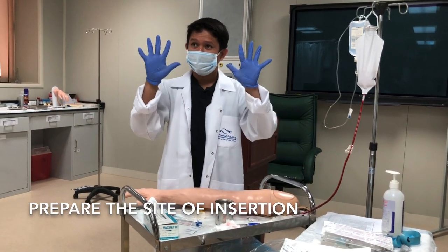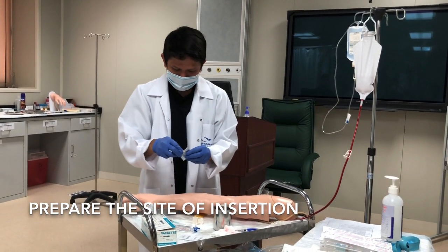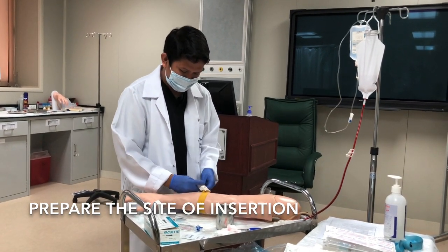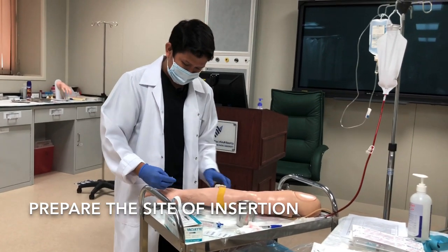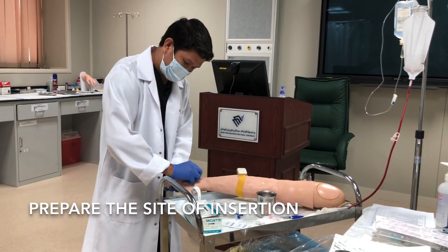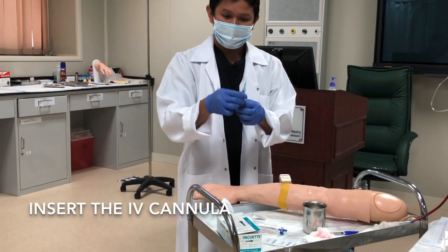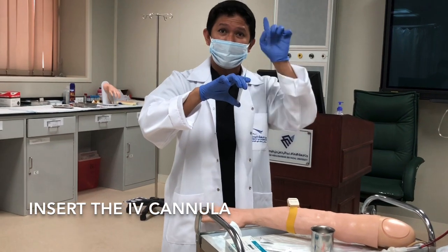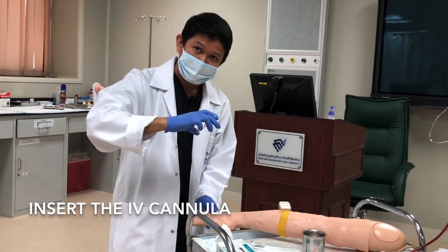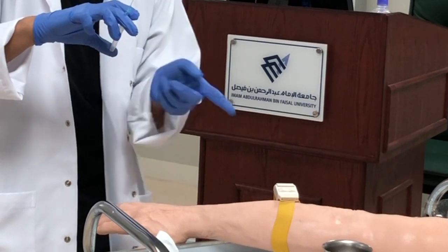You need to put on your gloves, and then clean the site. Apply the tourniquet and make it tight. Instruct the patient to close his fist, then clean the site again. Get ready to insert — bevel up, holding with your dominant hand, and using your non-dominant hand to stabilize. Stabilize and stretch the skin so that the vein will not move when you insert the cannula.